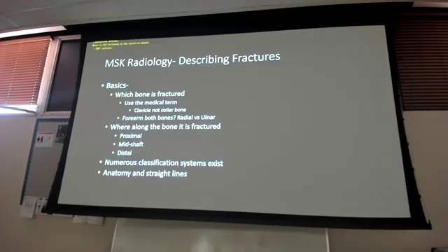Okay? Forearm. That doesn't tell me anything. Radius, ulna, right? Leg. Leg's not helpful. Femur, tibia, fibula, what's going on? Tell me the bone that's fractured. Then tell me where it's fractured. Proximally, midshaft, distally, what location? Help me paint the picture in my mind.